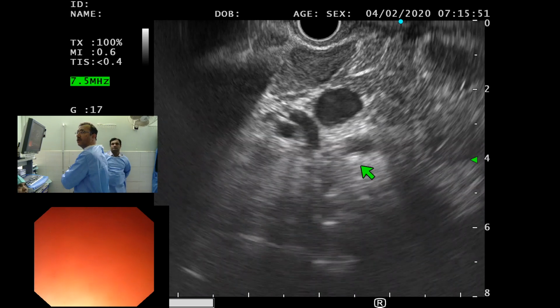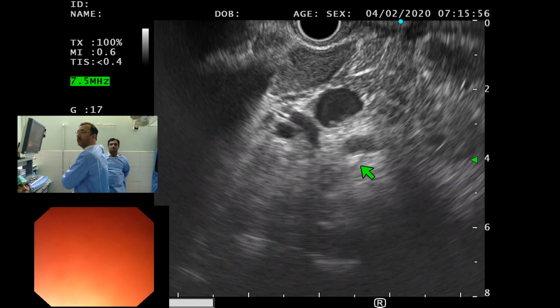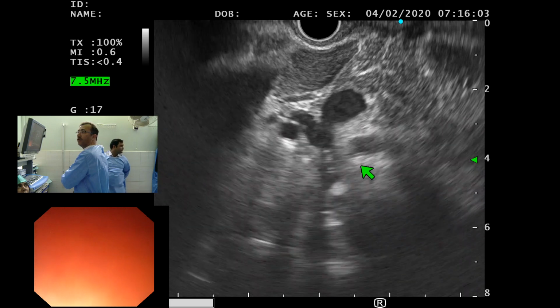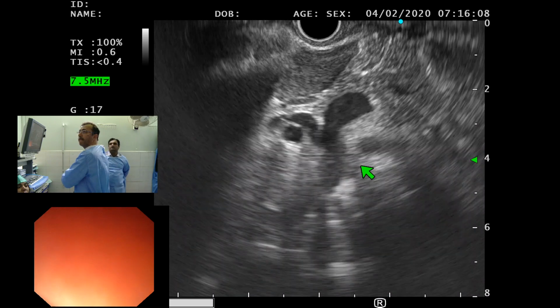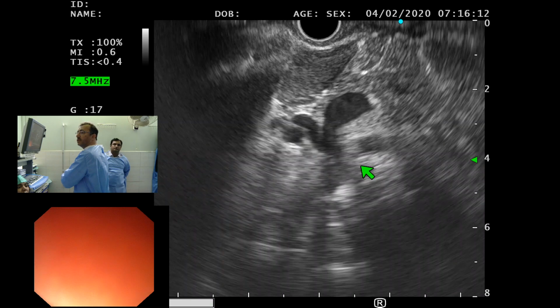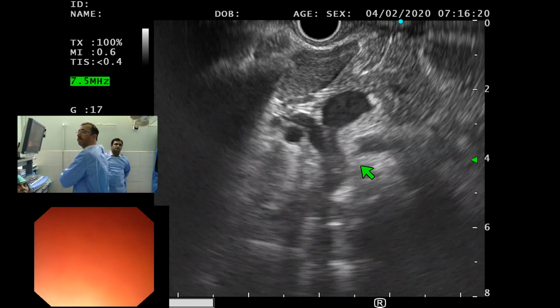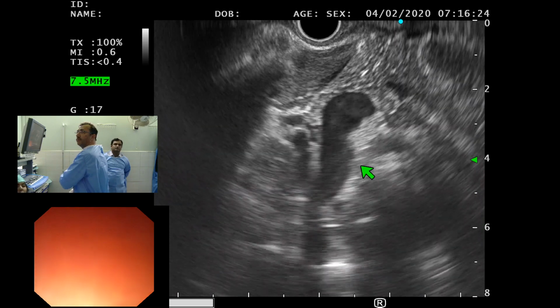Ever since you have switched to FNB, do you find any difference in your yield while you were doing FNAC and now that you have switched to FNB? Yeah, obviously you get nice core tissue with the FNB, but we still continue doing the on-site cytology, on-site evaluation. I think that's reassuring. Plus, I feel that it's also learning for us, so we continue doing it. I agree with you.